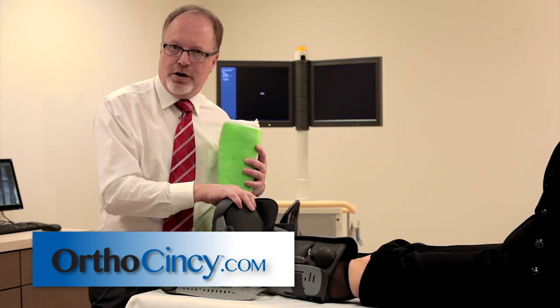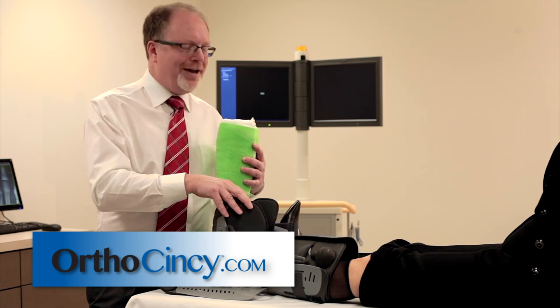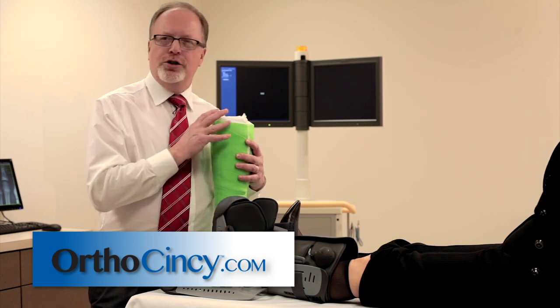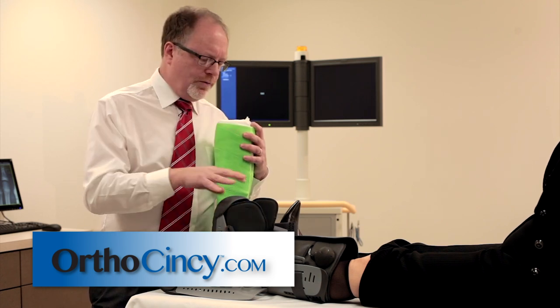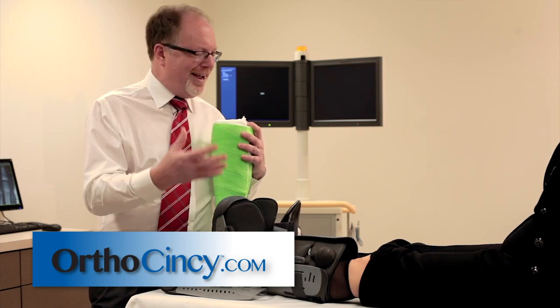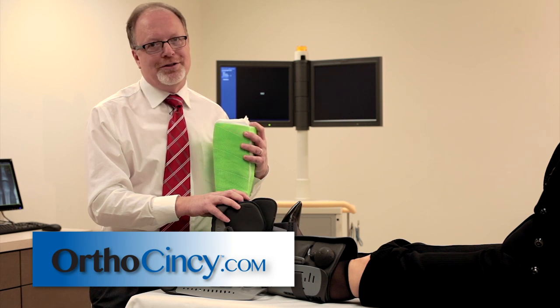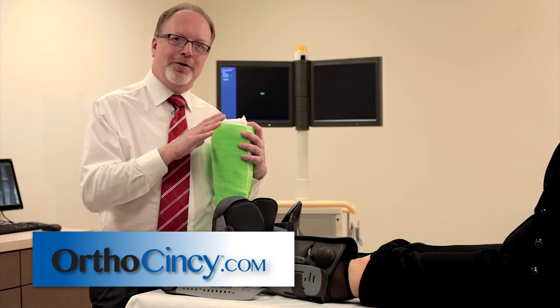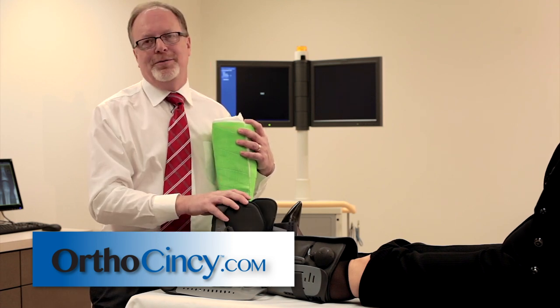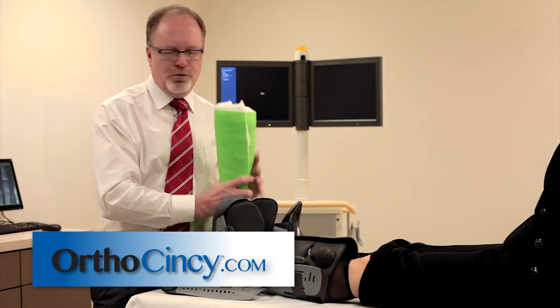That's the nice thing about a boot. A boot, although it's an off-the-shelf thing, can come off. You can take a break, take a shower or a bath. You don't have to sleep with a boot on in some cases. So how do you choose between the two? First of all, the boot has to fit. Since the boot is off-the-shelf, any woman with pantyhose knows that one size really fits some and no size fits all. If you're a little far out of the norm, you might want something custom-made like this. Second of all, you have to be good enough with the boot to use it right. So we're going to talk about boot rules.